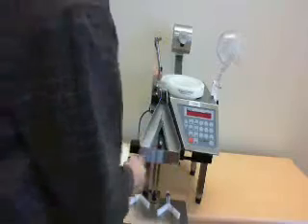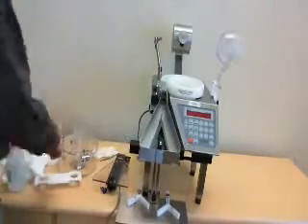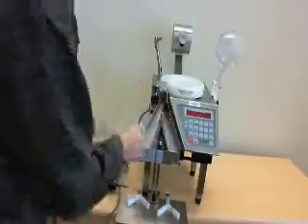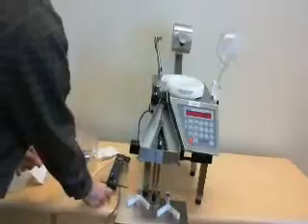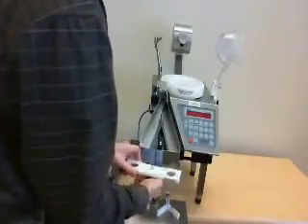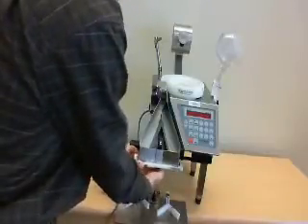This is self-evident. When your technicians become proficient at this, they'll need 3-4 minutes for cleaning, no longer. We do recommend that you clean your device at least daily, or especially in between different batch runs, to ensure that there is no cross-contamination.